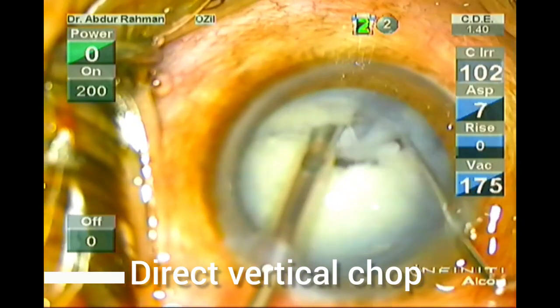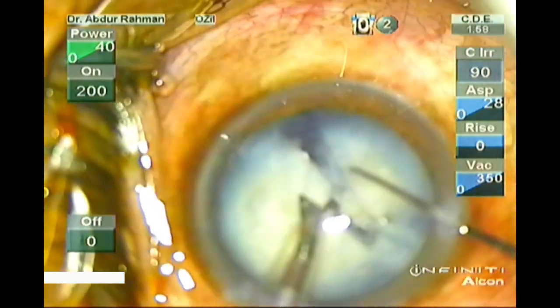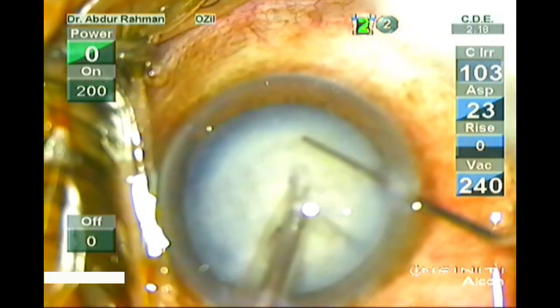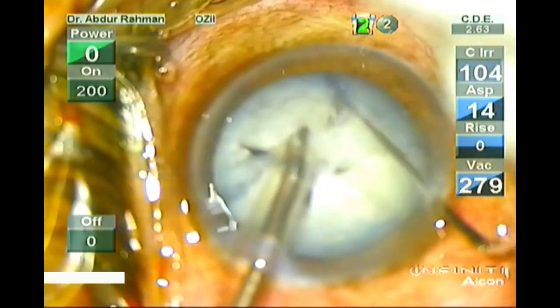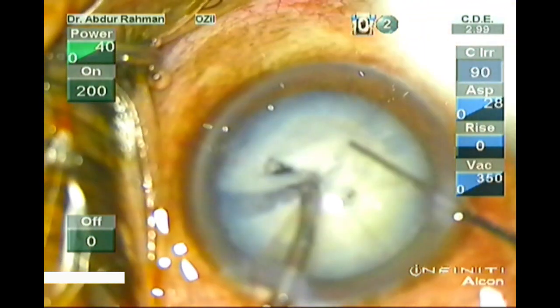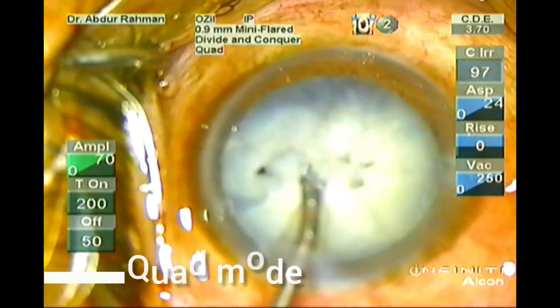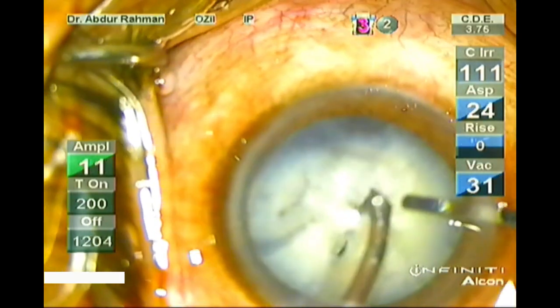Chop the piece. Now perform multiple chops in the back. I find vertical chop the most satisfying chop, followed by horizontal chop. Vertical chop is very easy — it comes easy to me. I have completely chopped all the pieces. Now I will remove the chopped pieces in quadrant mode.